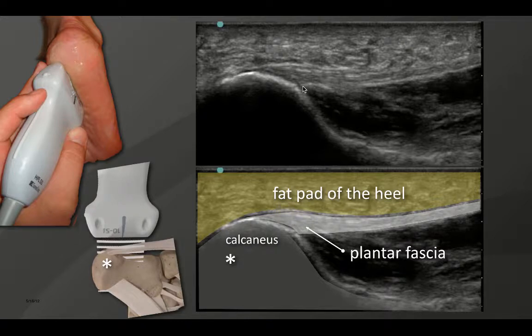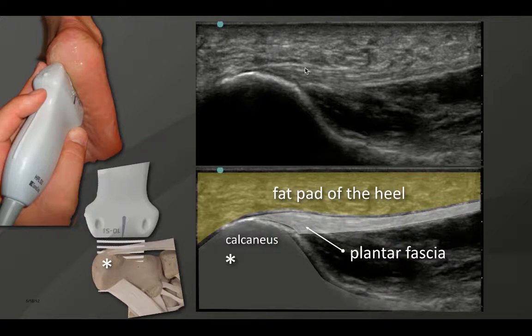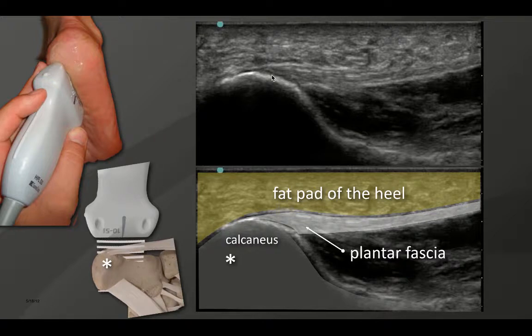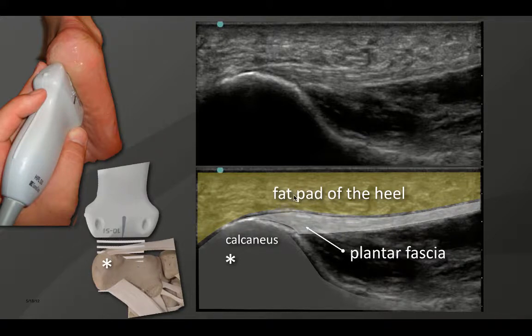There are standard measurements for the plantar fascia: the distance from the enthesis — or origin — of the plantar fascia to where it stops at the neck of the calcaneus. The superficial margin should not exceed four or five millimeters on anybody, regardless of their size. We see nice non-disrupted fibers here. Also note that we can see the neck of the calcaneus very well. If you do not see the neck, and all you see is the cortical margin coming to a very sharp abrupt shadow, you could be dealing with a very large bone spur. The fat pad of the heel is also a diagnostic and useful feature to this exam.